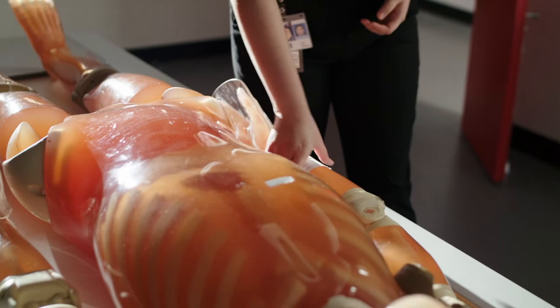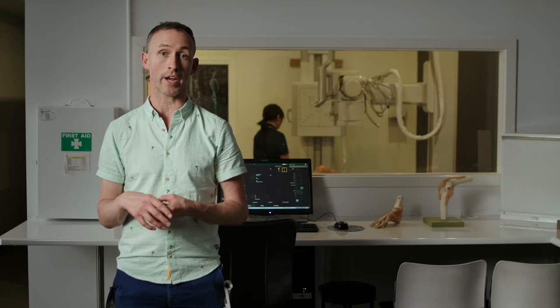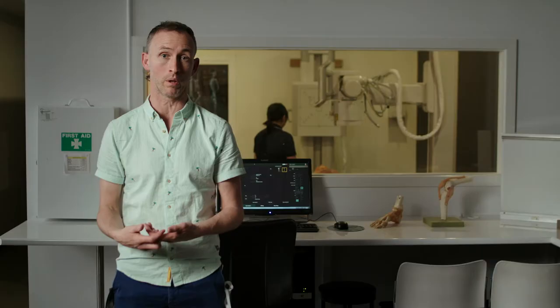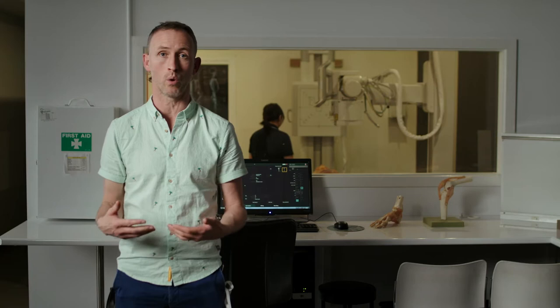Some patients can be quite nervous, of course, coming for x-rays, given that they're in the middle of a diagnostic pathway. So a large part of the radiographer's role is helping patients to feel comfortable, such that they know what's going on at all times, and so that they can have a very positive experience.